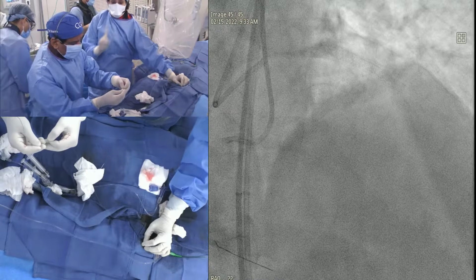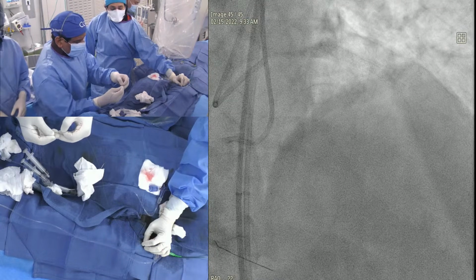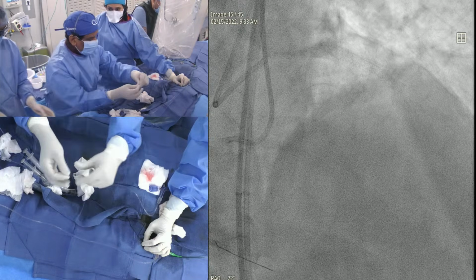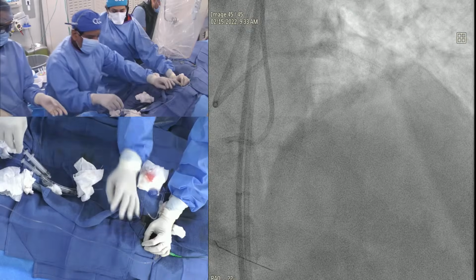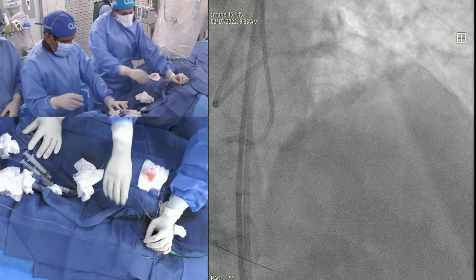I still want to do the Gold. Give the Gold. If this does not go, we try the Gold. If the Gold doesn't go, we are done. Gold without even... Let's see. Maybe it is better, because I've had good cases where it has gone. Okay. Don't fight Gold.